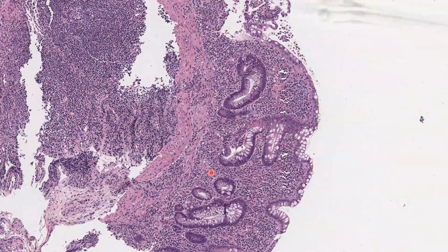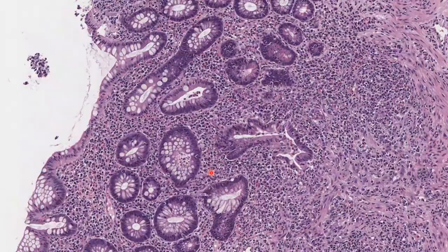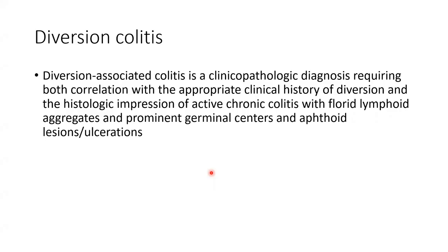If this was part of your pouch, not part of your isolated rectal findings, then you cannot make that diagnosis. If you have pouchitis similar to this, and you have a rectal biopsy similar to this, you cannot make a diagnosis of ulcerative colitis based on that.